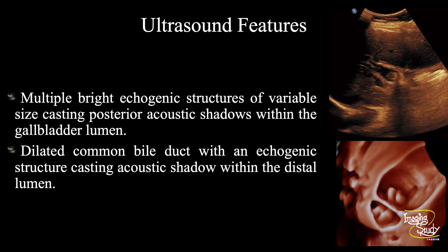So, in summary, multiple bright echogenic structures of variable size are seen within the gallbladder lumen casting posterior acoustic shadows. The common bile duct is dilated with an echogenic structure casting posterior acoustic shadow within the lumen, causing proximal dilatation of the common bile duct and the intrahepatic biliary tree. These features conclude it as a case of cholelithiasis with choledocholithiasis.